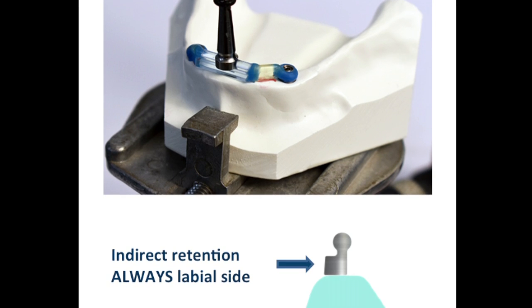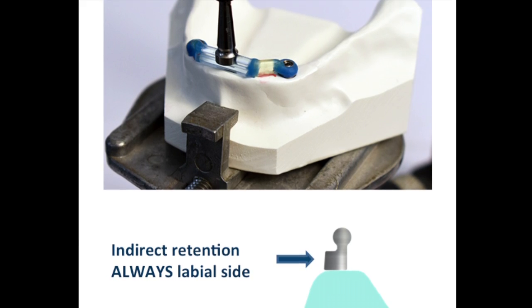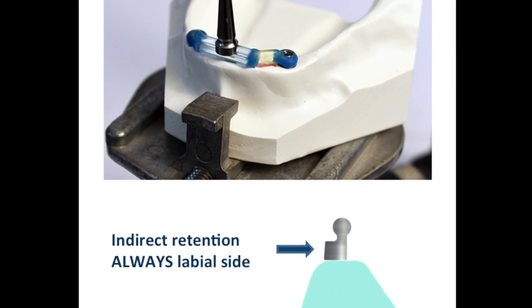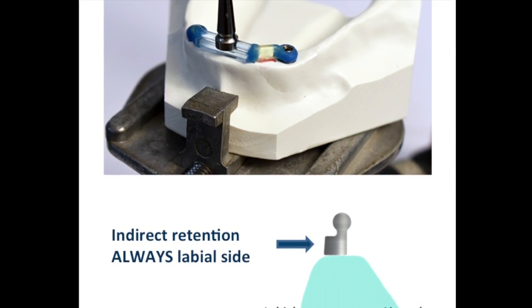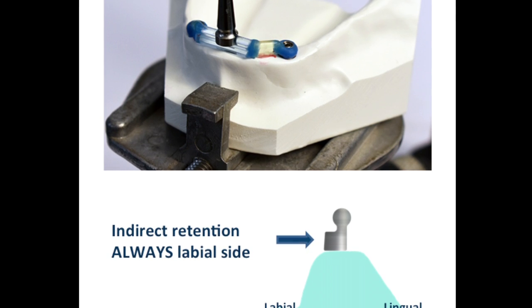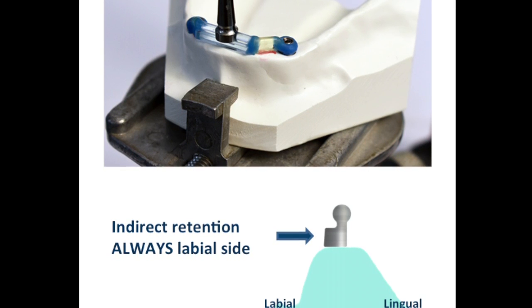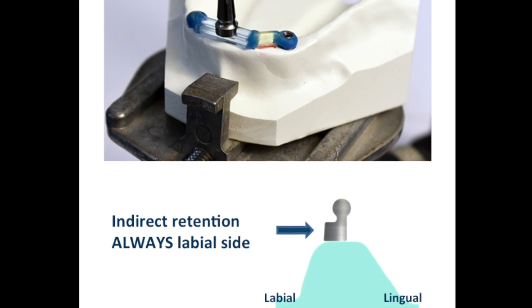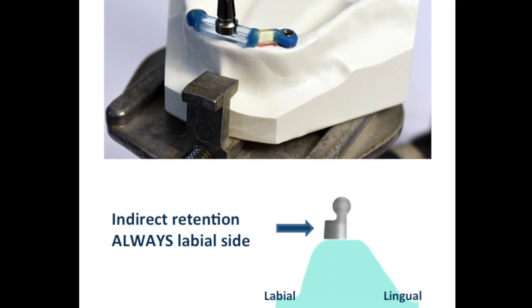You will notice a black rubber O-ring on the paralleling mandrel. I found that rolling it down about halfway held the plastic bar section securely. After positioning the pattern, I rolled it back up so that it was easy to pull the mandrel off of the bar pattern.